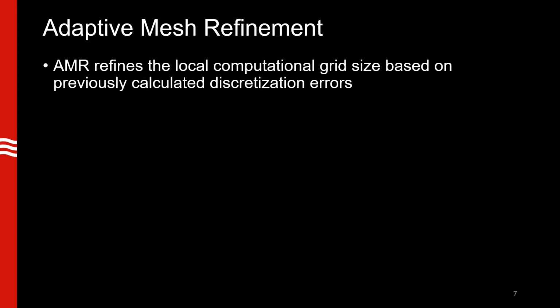The novelty in our study was the implementation of adaptive mesh refinement. AMR is a computational method where the grid size is autonomously updated locally and not globally. The regions where grid require refinement is determined with the aim of minimizing the calculated discretization error. AMR leads to more efficient CFD simulations by making the simulations less computationally demanding while maintaining the accuracy in our numerical results.